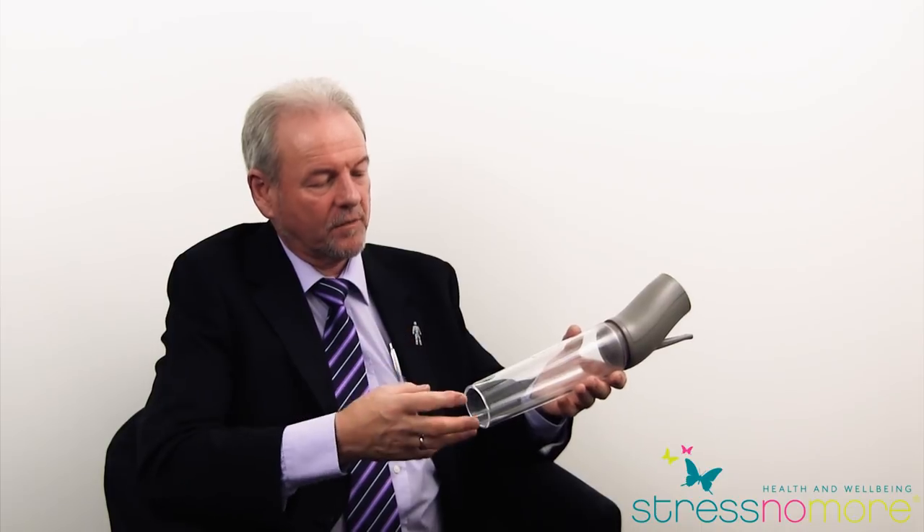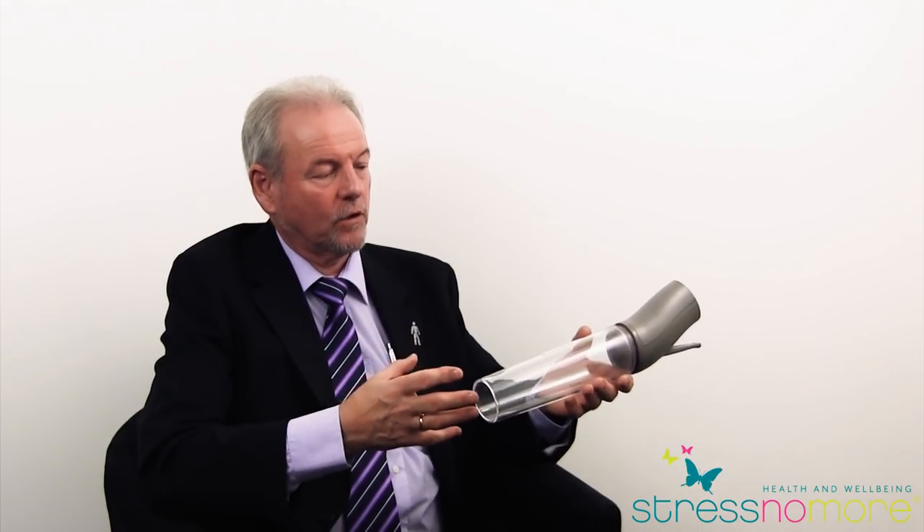Once you've got the pump, use it four or five times just as an exerciser. Don't move straight into using the rings. What you're wanting to do is develop the technique, find the technique that works best for you, and be able to achieve a good strong erection before you start experimenting to find the right ring size.